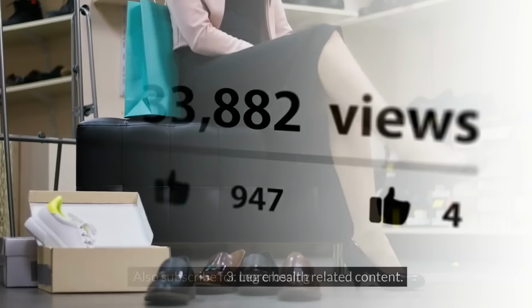The presence of clothing can also alter the amount of pressure the cuff needs to apply to occlude the artery. The cuff might require more pressure to compress the artery through the fabric, resulting in a higher reading than your actual blood pressure. Additionally, clothing can cause the cuff to sit improperly on the arm, either too loose or too tight. An improperly positioned cuff can fail to capture accurate readings, either underestimating or overestimating the blood pressure.